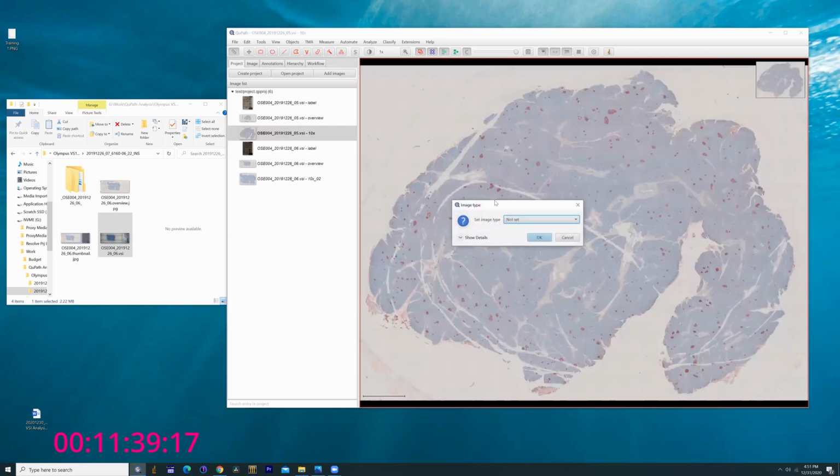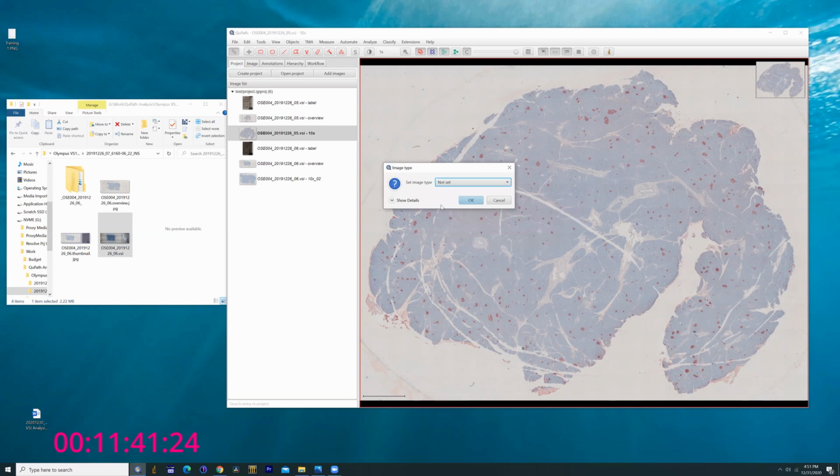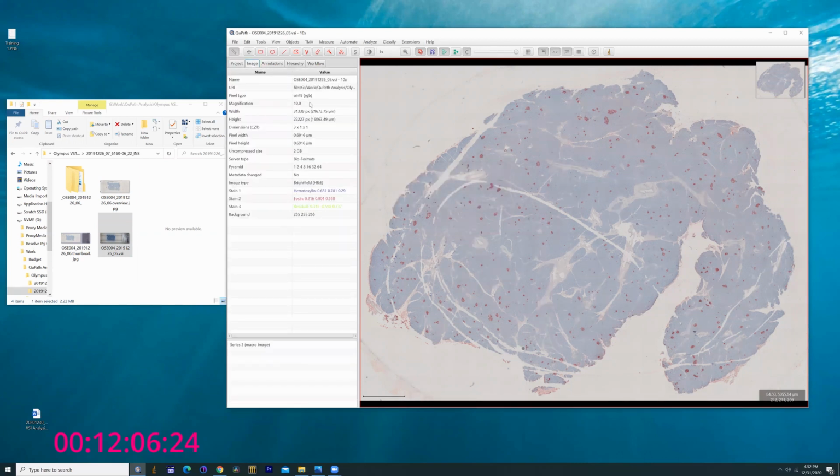By default, since it's a mixed chemical stain, the software is going to try to associate the file with a color pattern. The built-in options are bright field, hematoxylin and DAB, hematoxylin and eosin, bright field other, fluorescence and others. These are nice because they're not necessarily quantitative, but they have built-in filters already established as a starting point for the analysis. In this case, we're doing H&E, so we click on H&E, and that information is stored with the image once we save it.